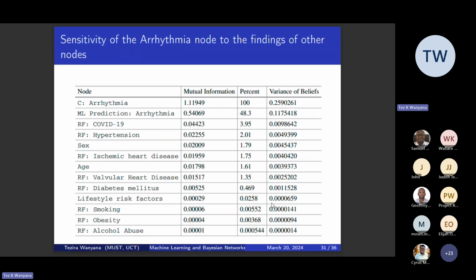implementing the values that we have for mutual information. So these are the values that we use to give the user predictive decision support. And if they do not know the answer to any of these conditions or risk factors, then they can just skip that and add information.